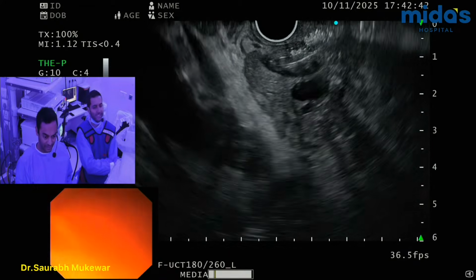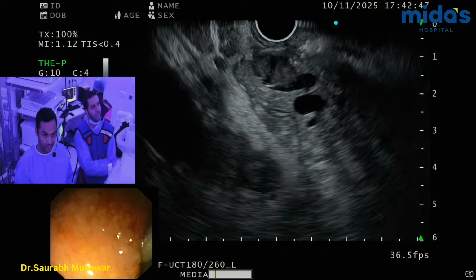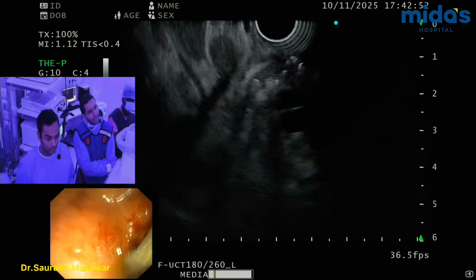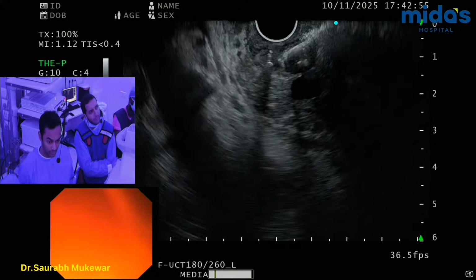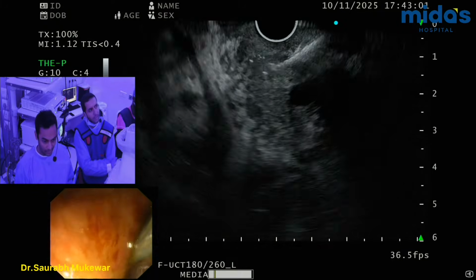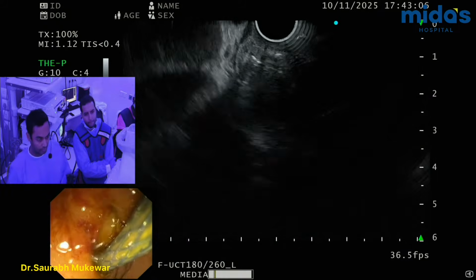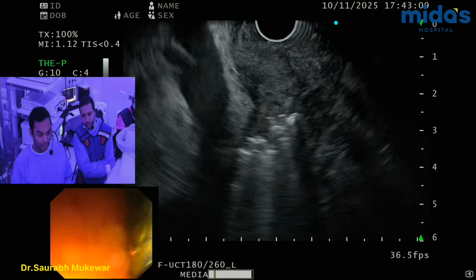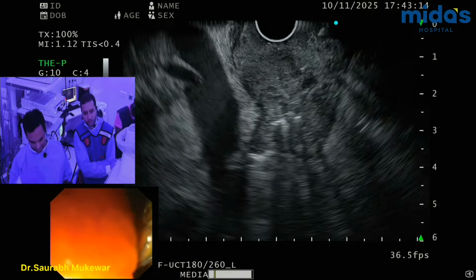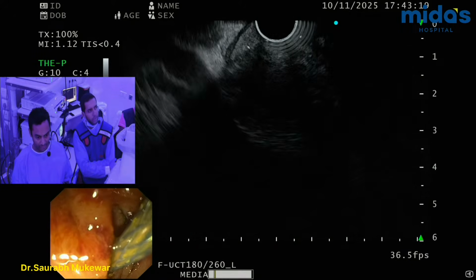Okay. So this is a problem. It's also a short wire technique, so I don't like that. Okay, wait. There you go. We got it. Cool. Done. We're sorted. That's fine. Okay, good. Ready? Deploy. It's okay. So just wanted to get it done. Angulation, but I think it will drain. It's fine. This will drain well.